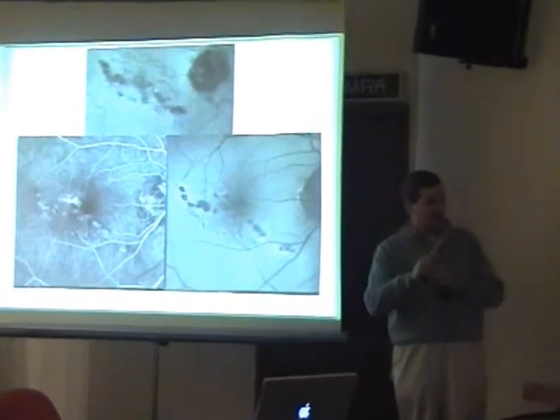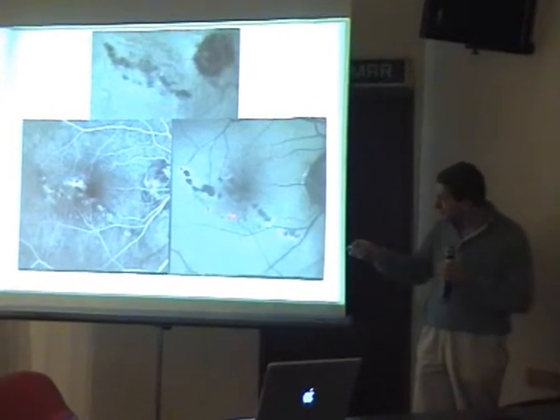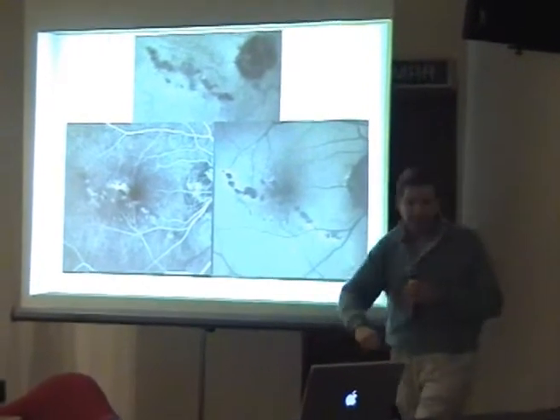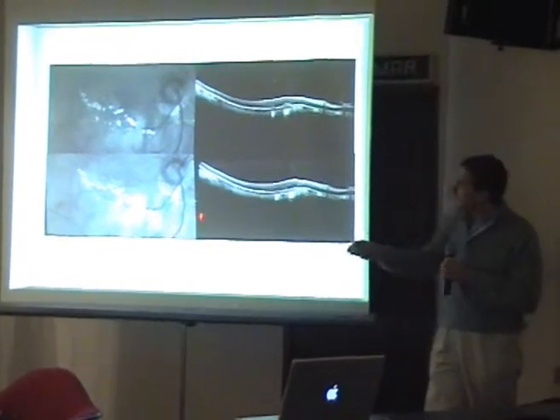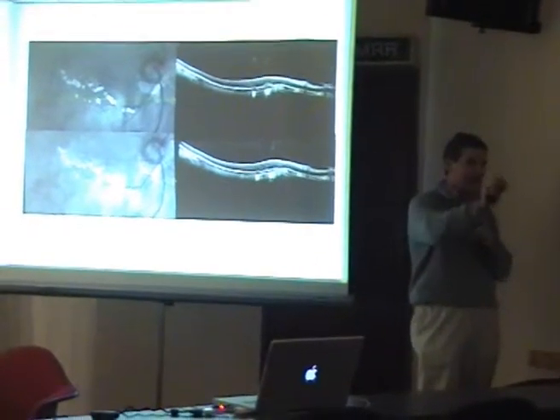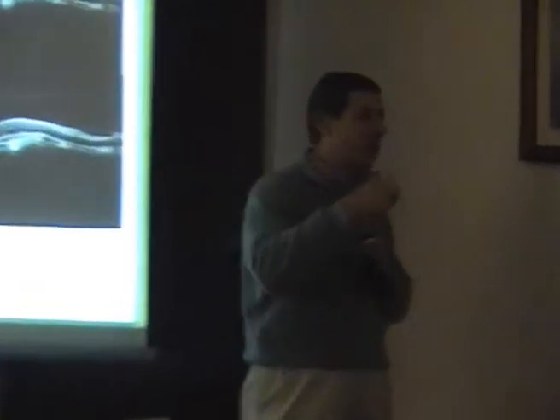Now I will show you something that to me was incredible. Cutting exactly here with the OCT, we have such an image. And this instrument is very good because you take an image as a reference, and after 1 second, or after 10 years, you can ask the machine to get exactly to that point.